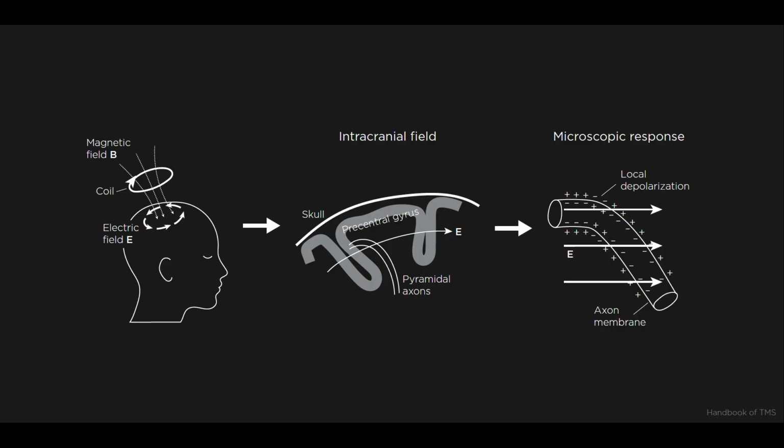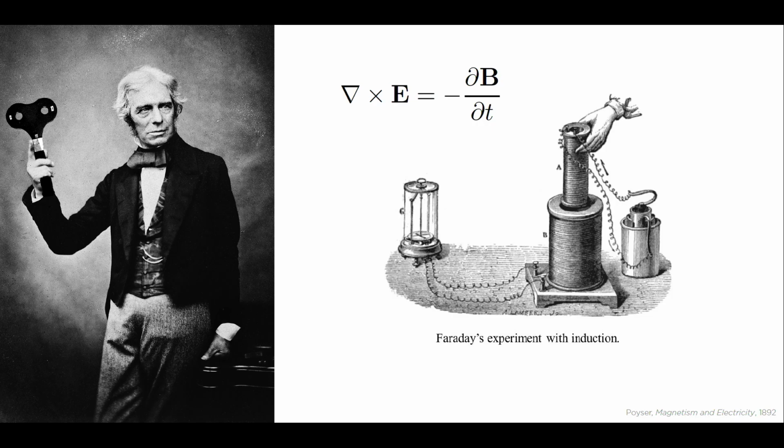The underlying physiology of TMS. So the TMS coil that is placed near the subject's head induces a magnetic field that is of a 2 Tesla magnitude. And this magnetic field, in turn, creates an electric field in the brain. When neurons in the brain are exposed to this electric field, the neuronal membrane potential changes. And when it reaches a certain threshold, this neuron underneath the coil will fire, causing action potential and subsequently behavioral effects.